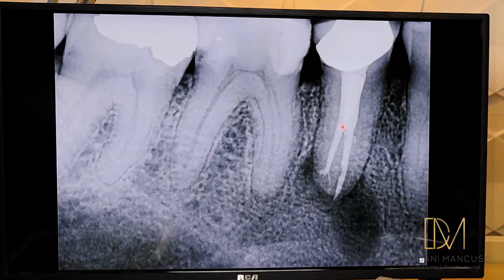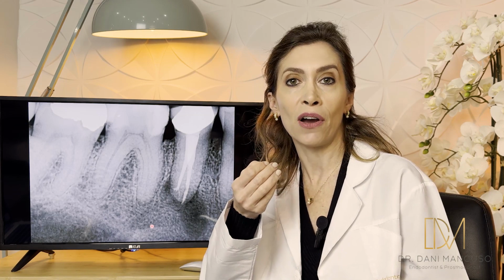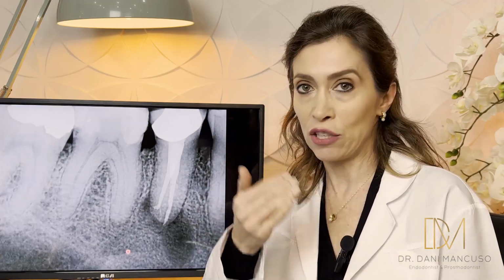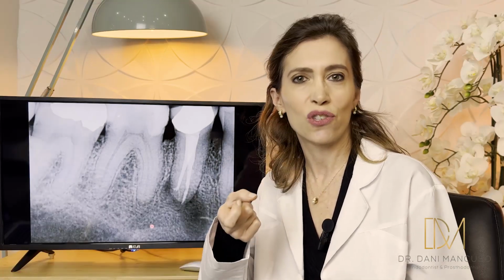And in this case, you can see that the curvature was about 90 degrees and quite at the very end. So pre-bending your file and starting with a very thin file, perhaps a 6, if the 10 is not going inside and very loose into the canal. You can try an 8. I would jump into a 6 straight away. A 6 is a bit tricky because if you force the file, it distorts quite a lot.